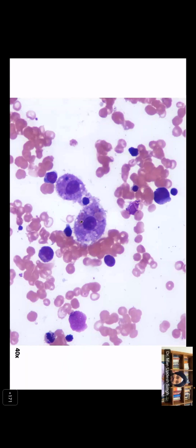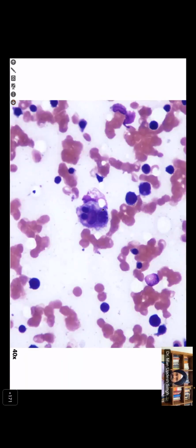macrophages, histiocytes, trying to eat up cells. Both of these are trying to eat up this one also. And some debris also. Vacuolated, they're angry looking, they are activated, they're engulfing cells. And more of these. So you see nucleated cells now in the cytoplasm. That's probably these macrophages. Macrophages, yes, the bubbly ones with a lot of cytoplasm.